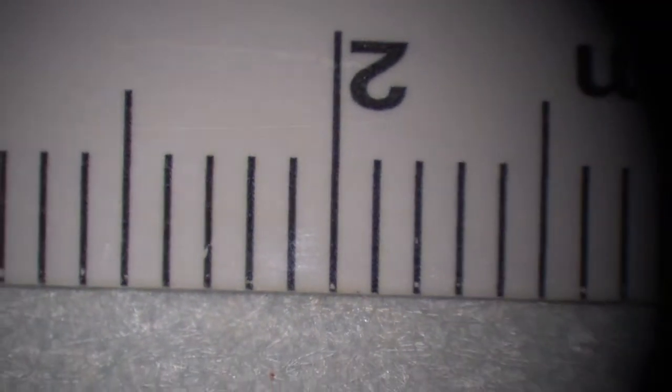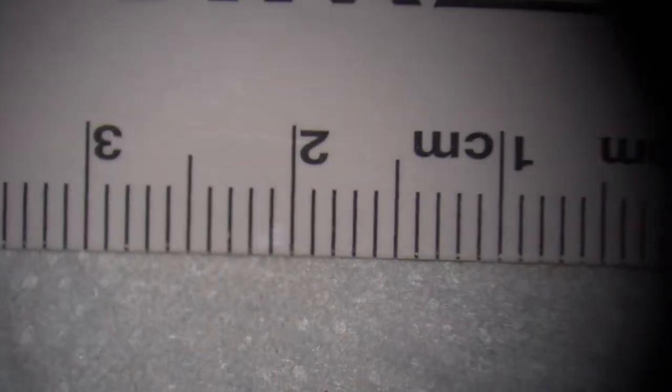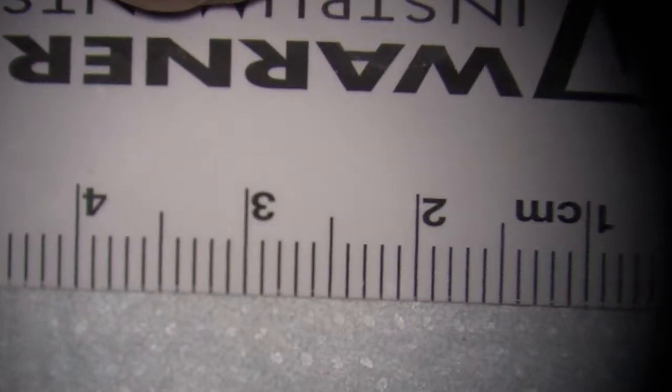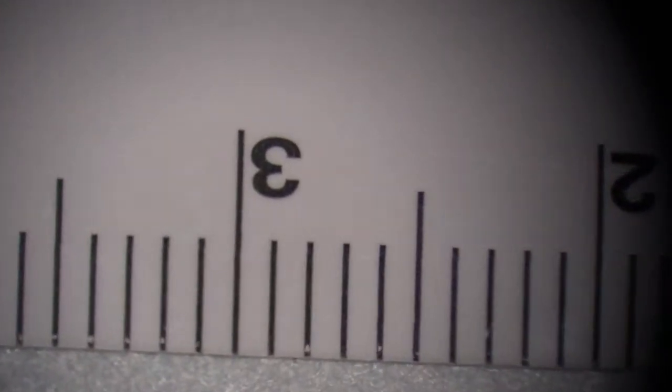Okay, now zoom out the microscope again. And then zoom in the microscope one more time. Just zoom in all the way. Oh yeah, there we go. Now this time, when we zoom in and zoom out, the microscope stays in focus. At the beginning, when we zoomed in, it lost focus. So it has some memory of the focus as we're going in.